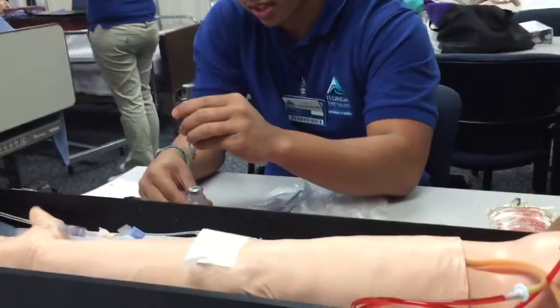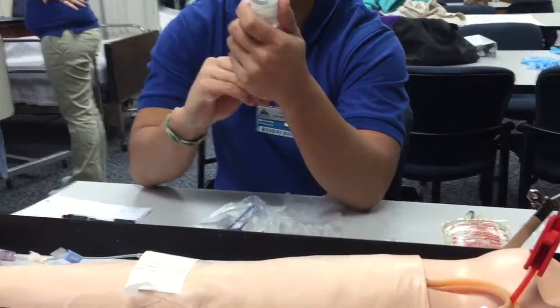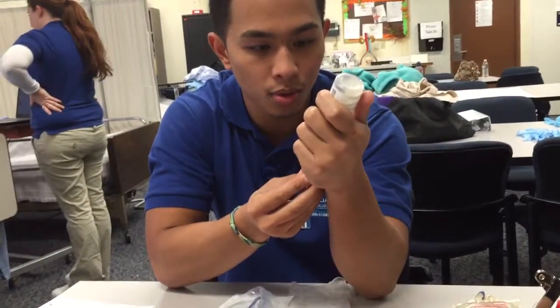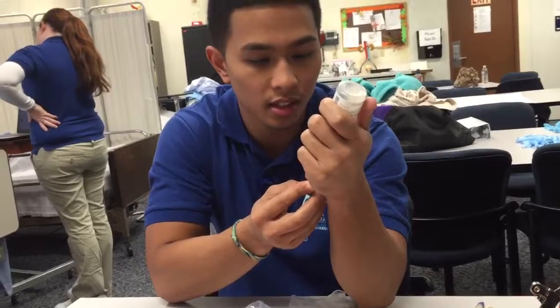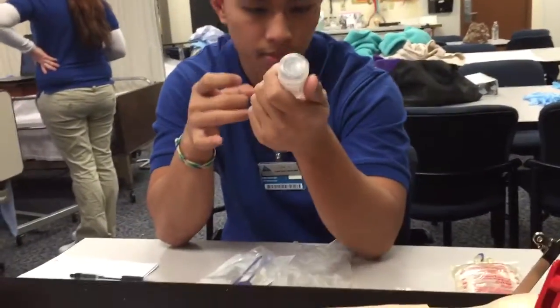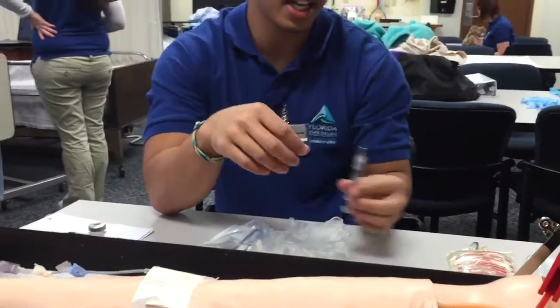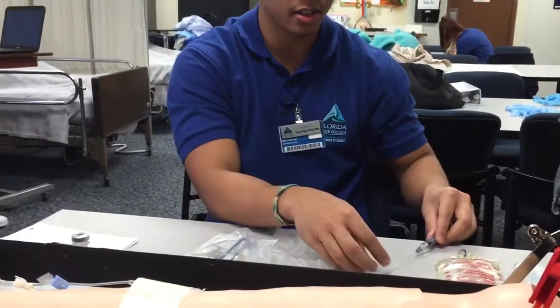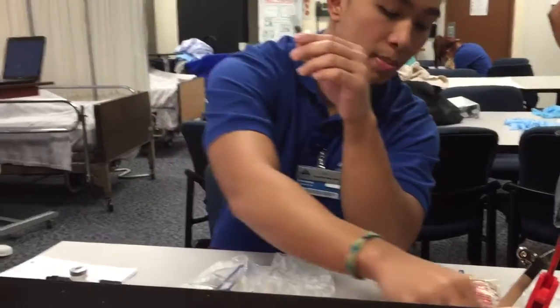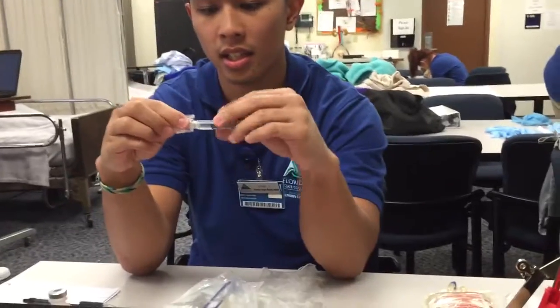We're going to inject the 1 milliliter of air into the vial, flip it over, and pull 1 milliliter of the medication up. I'm going to ensure that it is accurate to 1 milliliter. I'm going to take that out. I'm going to do the scoop method and throw this in the sharps for this purpose, but normally you would never recap a needle. So I'm going to put this into the sharps, and this is a brand new needle. I'm going to banana peel this and connect the needleless device.